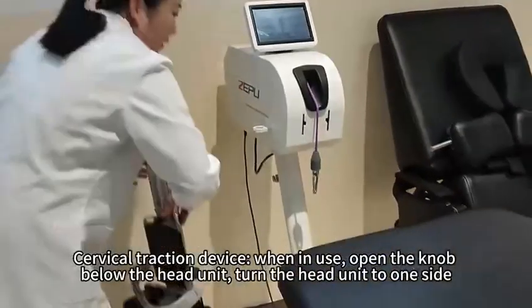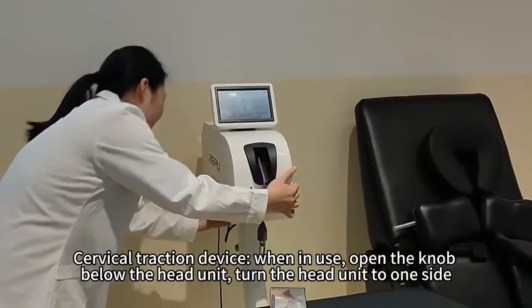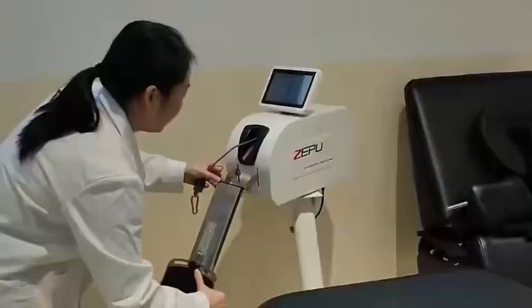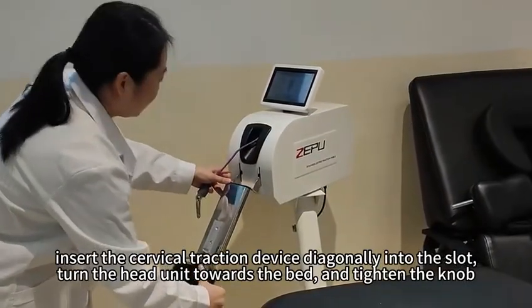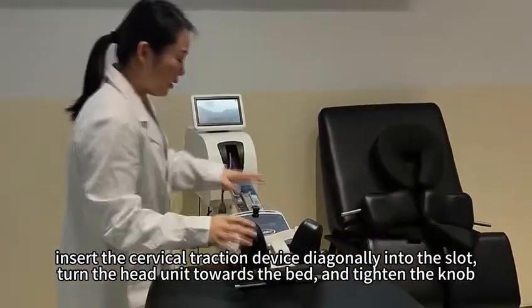Cervical traction device: when in use, open the knob below the head unit. Turn the head unit to one side. Insert the cervical traction device diagonally into the slot. Turn the head unit towards the bed and tighten the knob.